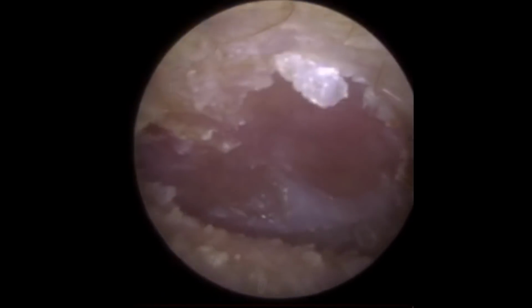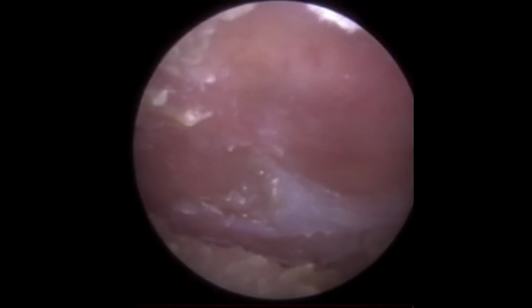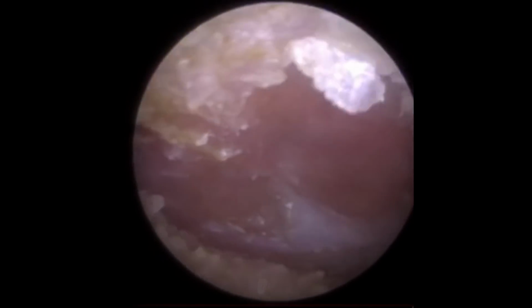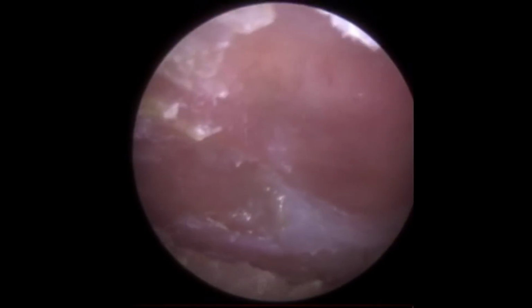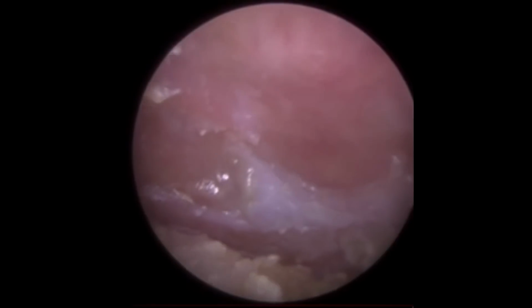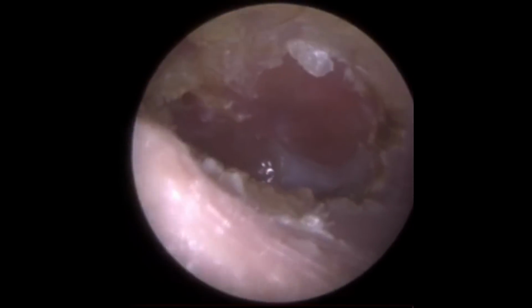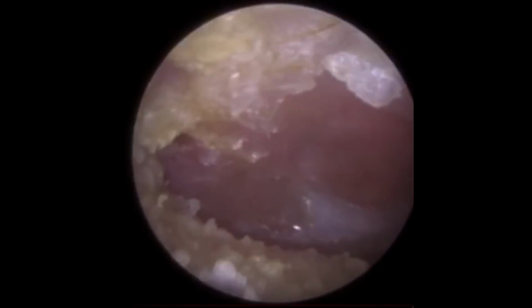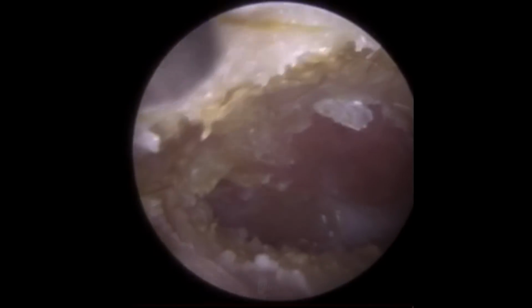So I've just removed a big piece of dead skin. Now, that is the eardrum, believe it or not. You can see it's very red. You can't see your usual landmarks. So when you look at a healthy eardrum, the eardrum should be translucent, so you should be able to see slightly through the eardrum into the middle ear. You should see the hammer bone, what we call the handle of malleus, and sometimes you can also see the incus, which is the anvil. Not always, but sometimes you can see that.